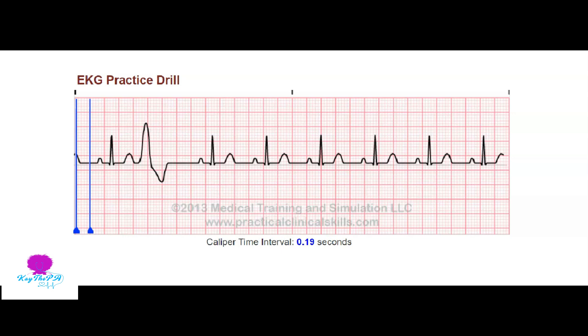When we look at our EKG strip, the first thing we're going to do is form a general impression. We're going to look for anything weird, dropped, or missing. I see this weird-looking thing right here - it doesn't look like anything else - so I'm going to circle that and pay attention to it.